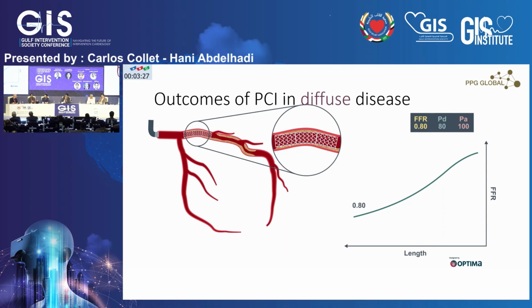If you think of this conceptually, it makes perfect sense because the amount of plaque or vasculopathy that happens in diffuse disease fits with every CT study that we've come across, right? The more plaque you have, the more likely you are to die.